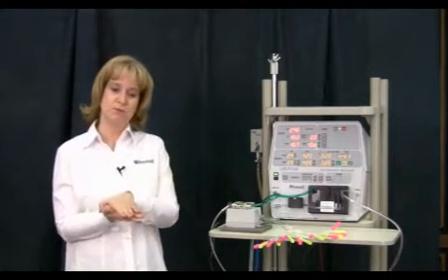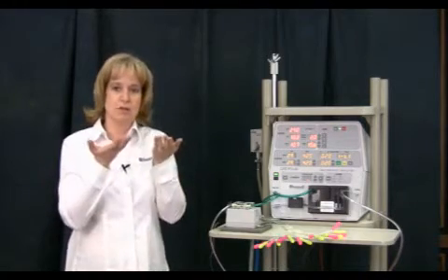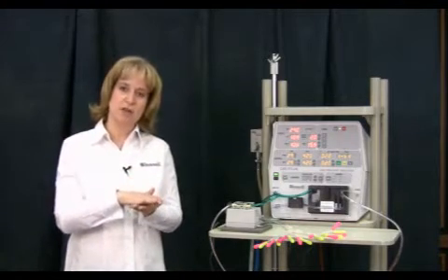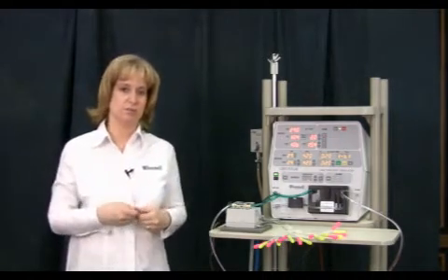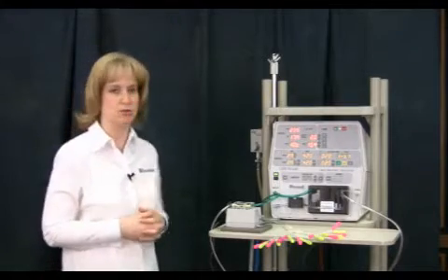If you flip the baby onto the right side and you have a huge leak, then your servo pressure is going to be a little higher. It's providing more gas flow to compensate for the gas that's being lost. If you flip that baby over to the other side, you'd expect your servo pressure to come back down because you don't have as much of a leak on that side. So make note of those types of situations so that you know, when the baby's being repositioned, what could happen to your servo pressure.